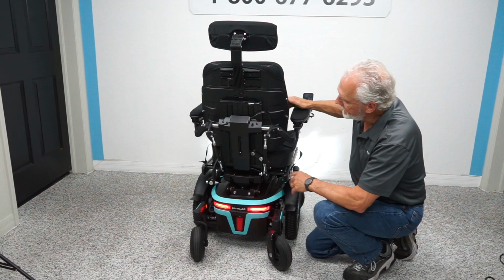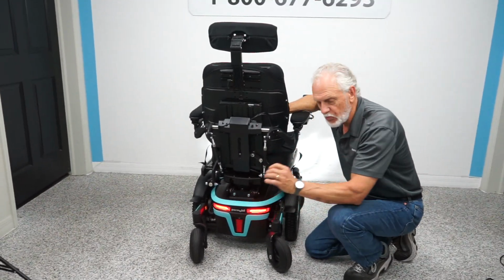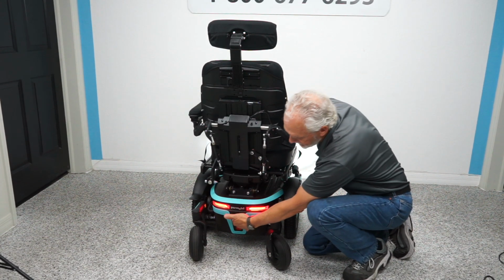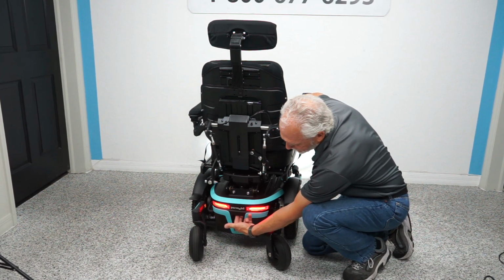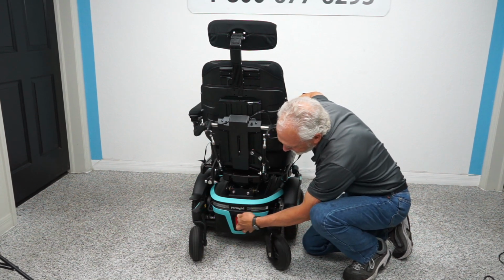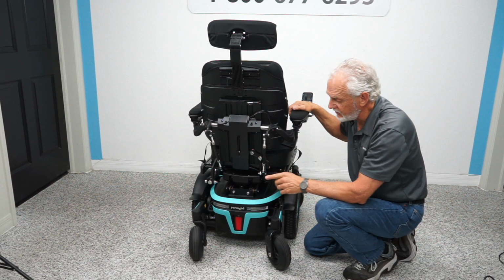Also with this chair, when we ship these chairs, we always turn the power off. So your breaker switch is right here where my finger is. So you see the reflector back here? All the way on top of the reflector, if you put your fingers up like this, you'll feel right there, there's a switch. Well, there you go. I just turned it off. That's your breaker switch right there. That's where you need to go.